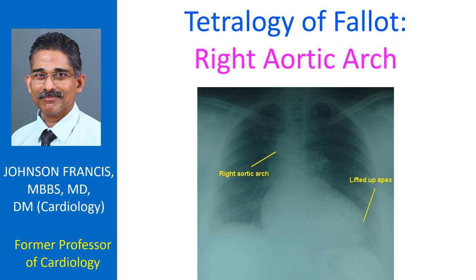The right sided aortic arch is seen indenting the tracheal air column on the right side. There is mild cardiomegaly and right atrial enlargement as well in this adult person with tetralogy of Fallot and associated inferior wall myocardial infarction. The lung fields are oligemic due to the right ventricular outflow tract obstruction in tetralogy of Fallot.